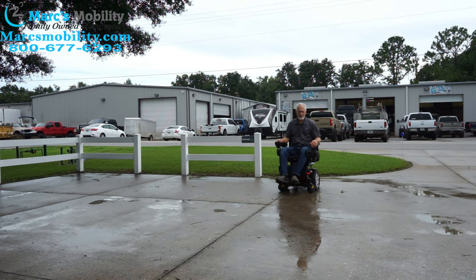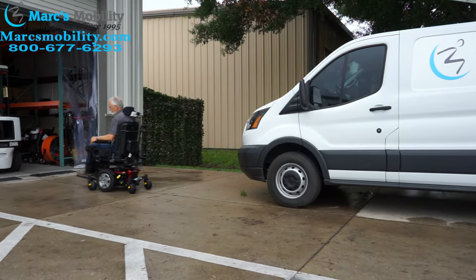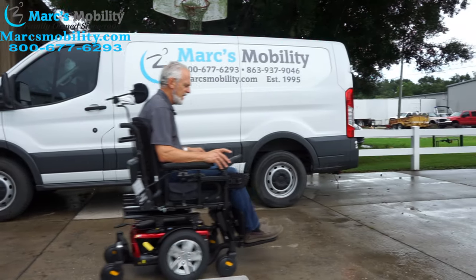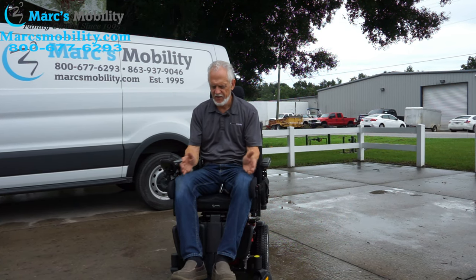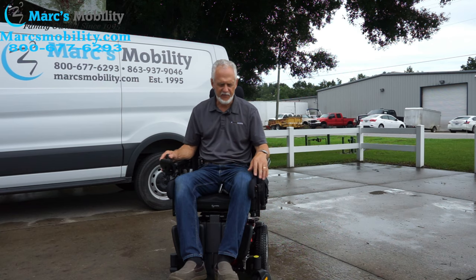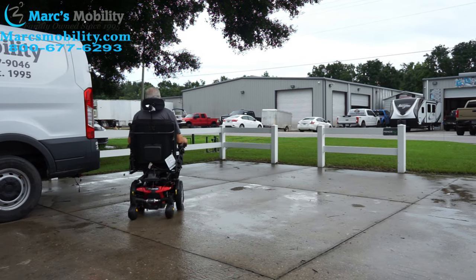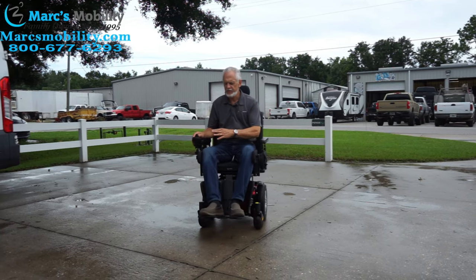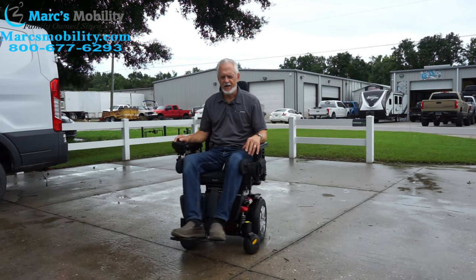This is the Jazzy J4 power chair. Top speed is about 5 miles an hour, with electric tilt and electric legs. As you can see with my knees and these lateral pads, it's really impossible for my foot to come up because my knees are buckled out and this is holding me in. It keeps your feet right on the foot plate. Six wheels on the ground at all times — great suspension. The response is really slow, which is good if you have someone who's skittish.